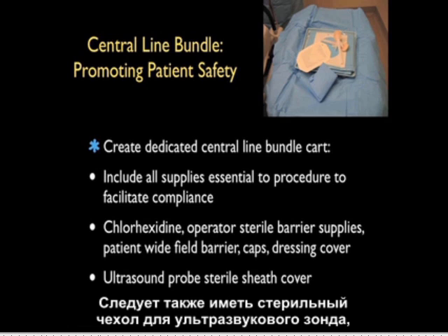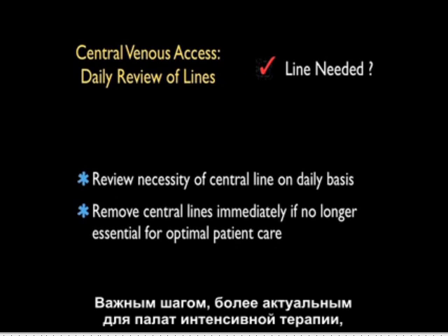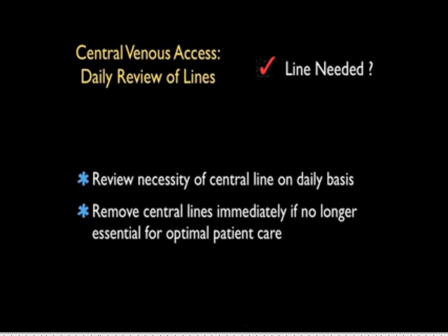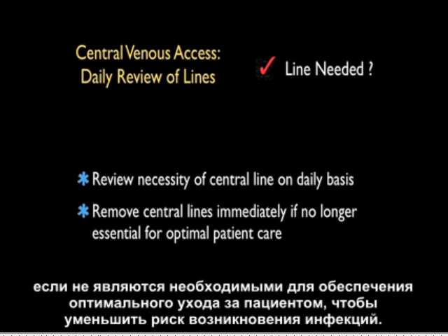One should also have the ultrasound probe sterile sheath cover to facilitate the use of ultrasound in a sterile manner during the procedure. A crucial step that's more relevant for the critical care units is a daily review of all central venous lines to see if the line is truly needed. All unessential lines should be immediately removed from the patient if not essential for optimal patient care to decrease the risk of infections to our patients.